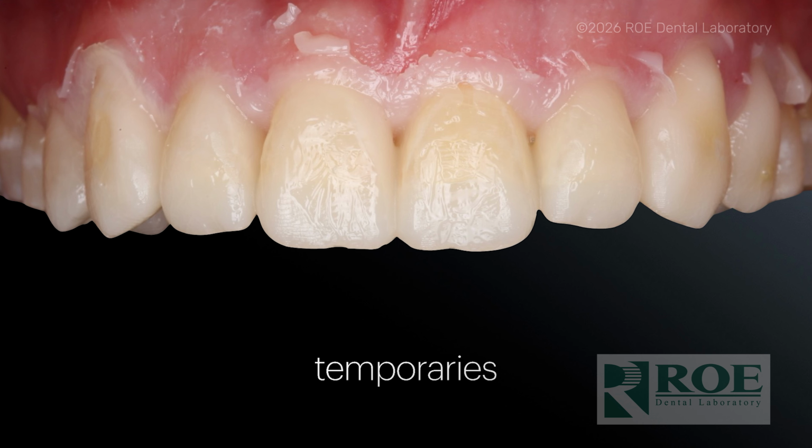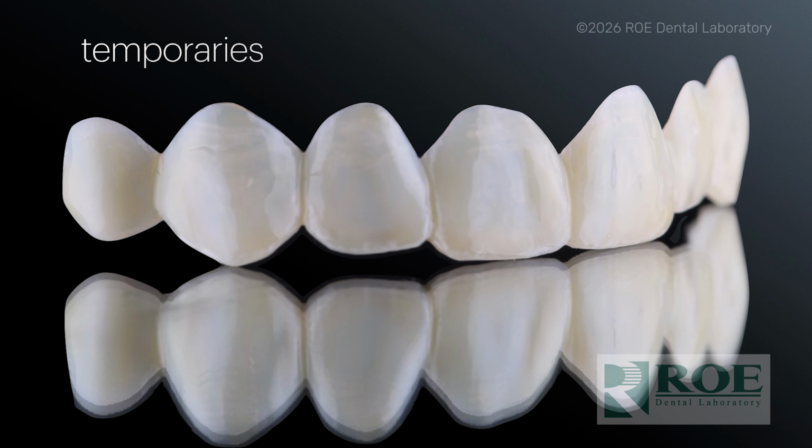And at the end, if you think about your full arch preparations at this point, you've spent an entire morning, or afternoon, prepping all of these teeth, and now you're making these temporaries, your assistant is, and everybody just wants to be done. And now we've got these crappy temporaries. What changed for me is when I could go from this style temporary that I had to grind into place and beat up the tissue, and then the margins were never good, and so we go to bond and everything's a bloody mess, to something more like this.